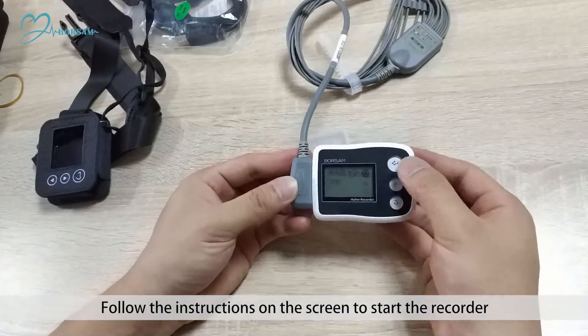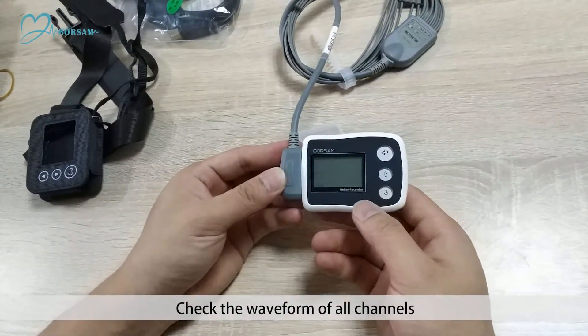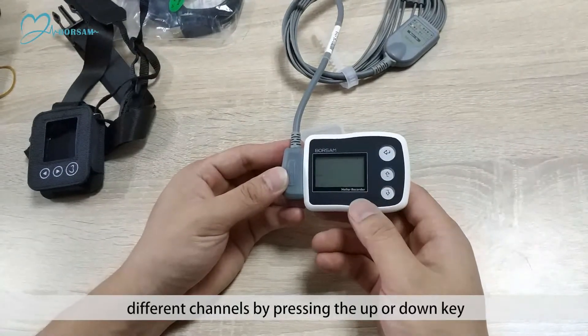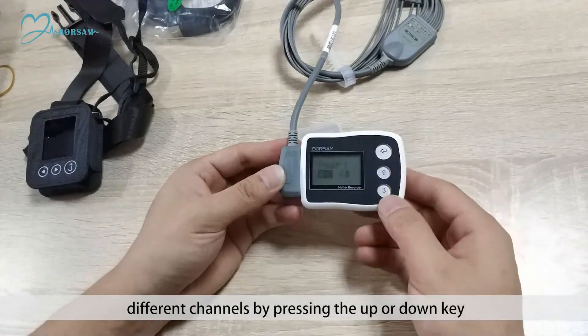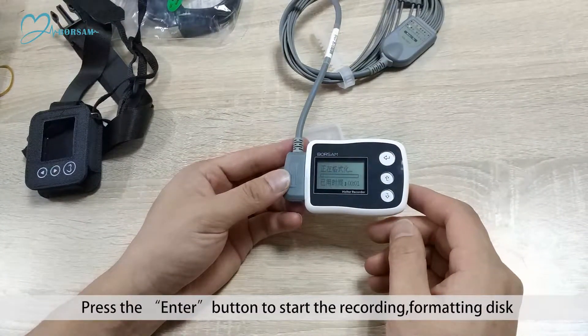Step 9: Follow the instructions on the screen to start the recorder. Step 10: Check the waveform of all channels. Step 11: Switch between different channels by pressing the up or down key. Press the enter button to start the recording.